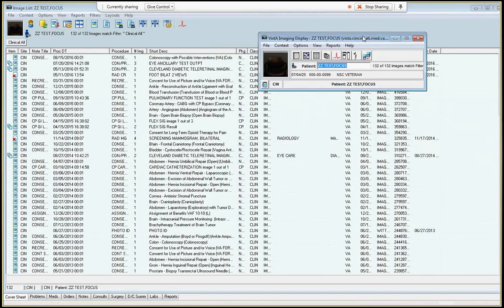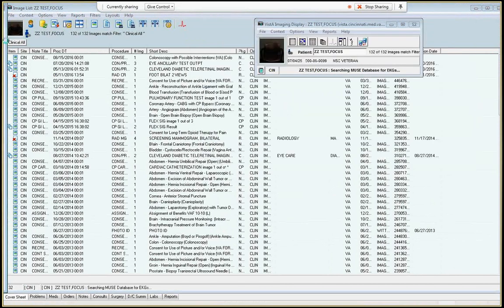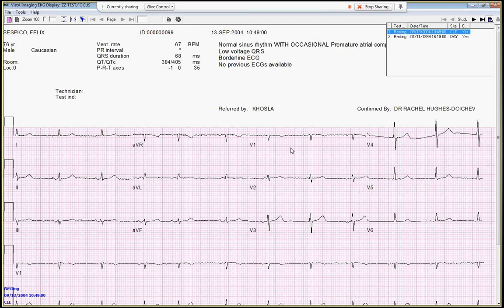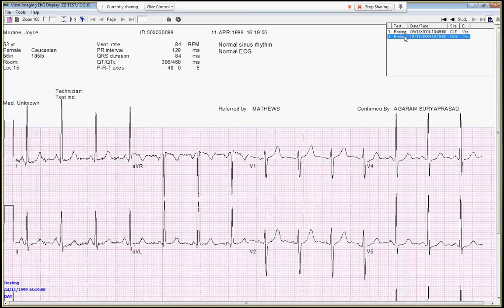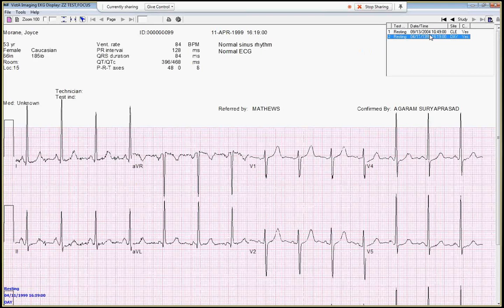Then you'll get these two screens pop up. You want to click on this QRS complex, and it'll show every EKG that they've ever had in the past. This one has two sample EKGs, which is great because what I want to show you is how to pull them up side by side, or actually top to bottom. So this is the new one, this is the old one.